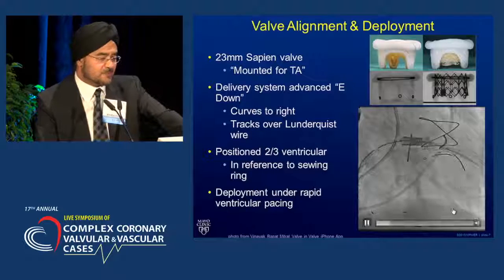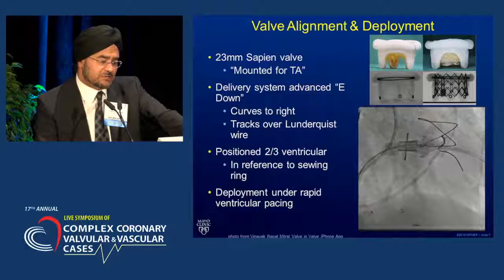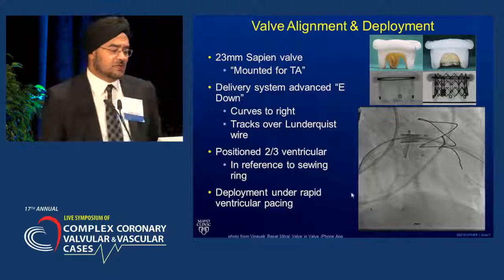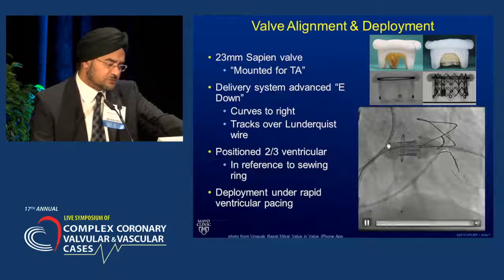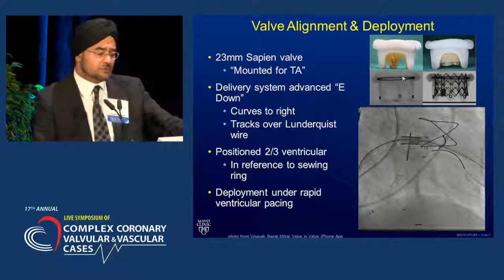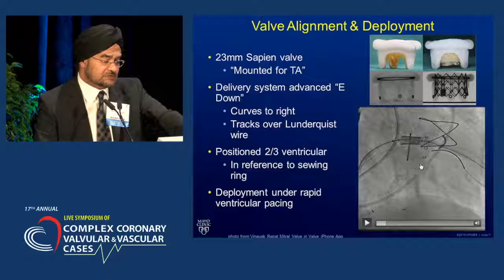This is transfemoral, transvenous — there's no apical stick. What we're doing here is putting an Edwards Sapien valve into the Hancock II. The Hancock is a 27-millimeter, and the internal diameter as we measured it was about 22 millimeters, so we felt a 23-millimeter Sapien would fit really nicely. Before somebody starts to do these interventions, you really have to understand the construction of these valves and the measurements. We take pains to get valves, handle them, look at them, talk to surgical colleagues, and bench test various valves inside them.